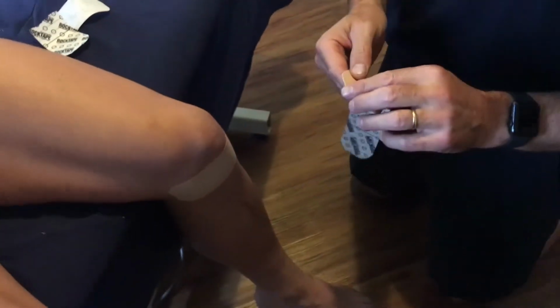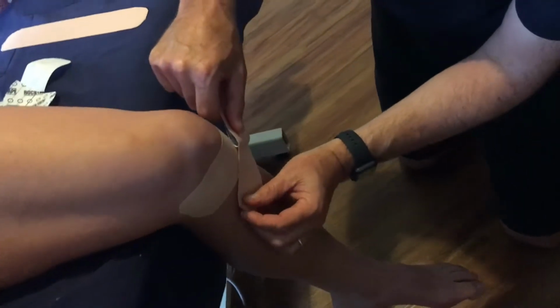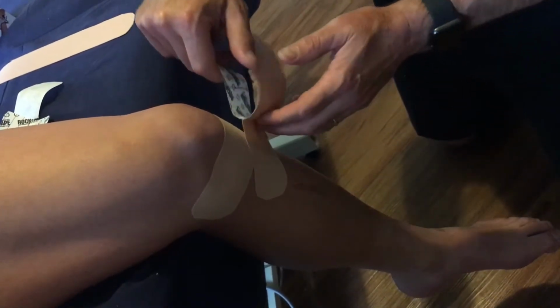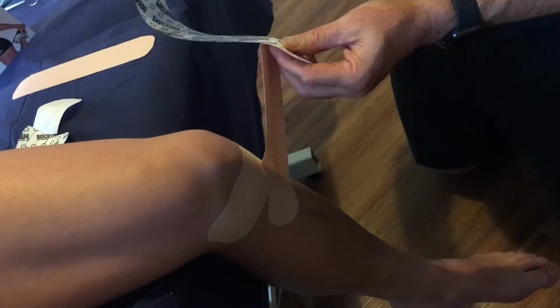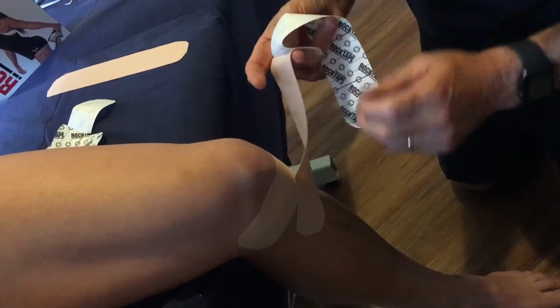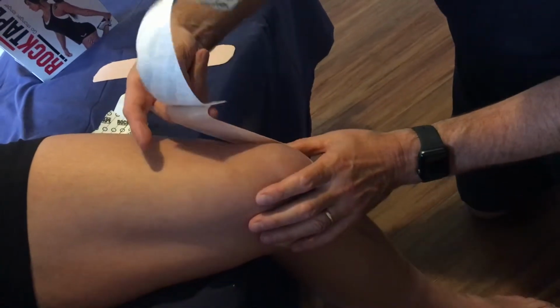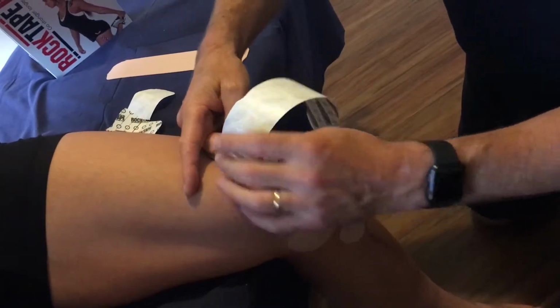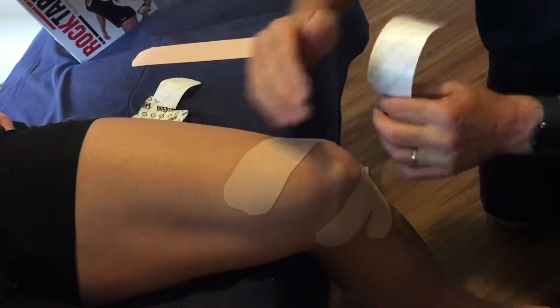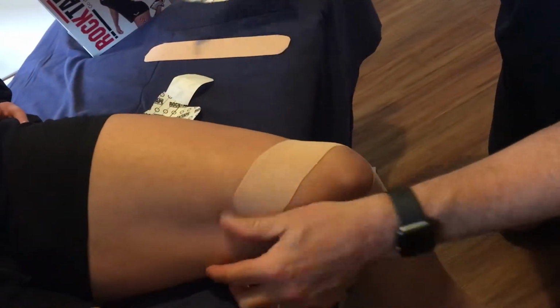Alright, so now we're going to put on the other 2 bits. 25 centimetre bit. We're going to start down low, in front of the shin, pretty much over the shin bone. That first bit has no stretch on it. We then pull the tape up until we've got about 5 centimetres left and try and keep the tape out of the way. And then we, again, about 50% stretch, we come around the outside, lay the tape down, and then that last bit we just roll on. So there's about 5 centimetres with no stretch at either end. Give it a bit of a rub, make sure that it's well adhered.